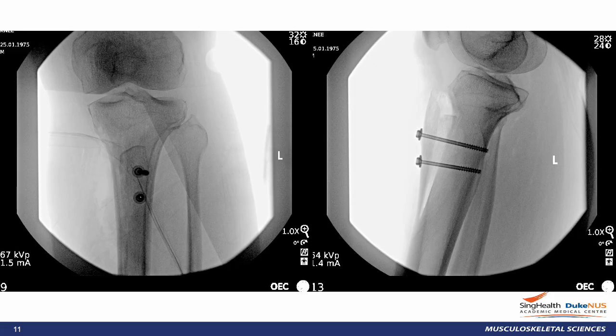Intraoperative fluoroscopy is used to ensure the integrity of the distal hinge. A femoral head allograft is then prepared and inserted into the gap. The TTO is secured with 2 cannulated screws placed in an anterior to posterior direction.